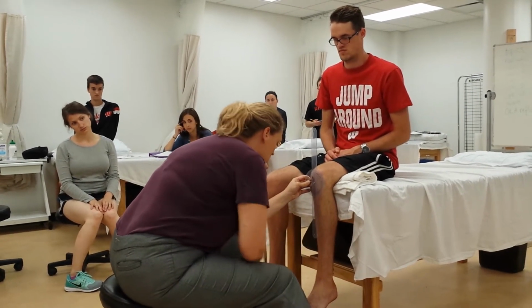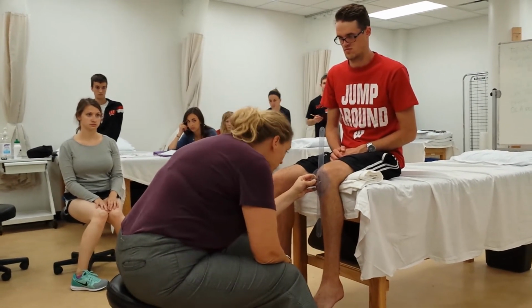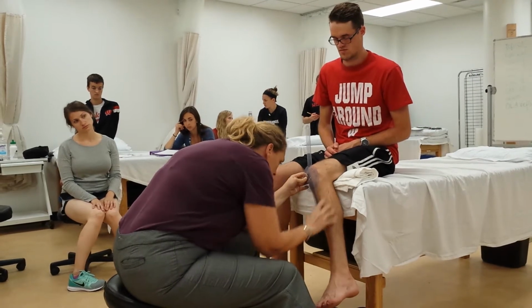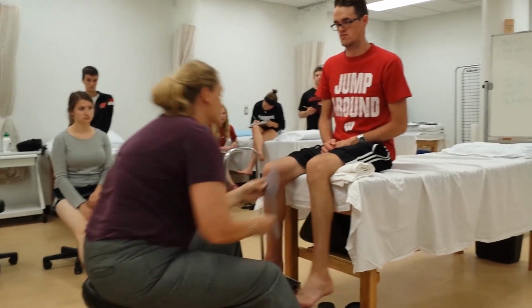The moving arm is going to go right along the shaft of his tibia. Okay? I'm going to just show active, so I'm starting to feel lazy. So let's do medial rotation. So go ahead and bring your ankle out. Okay, keep your leg down on the, there you go. All right, relax. That's 0 to 30.